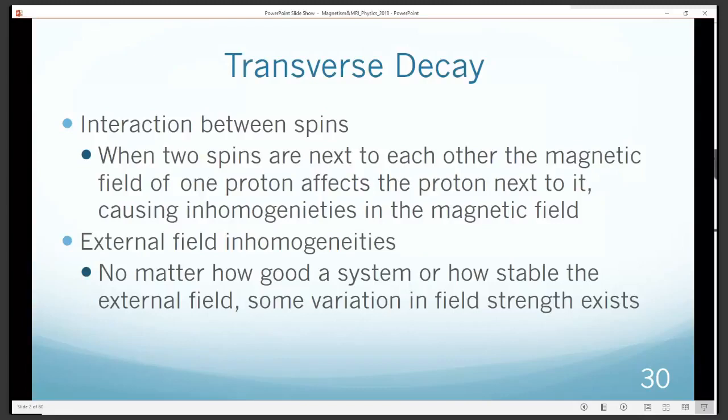And it's mainly, as the signal from the piano string decays, due to frictional elements in the string, causing its resonant properties to not be able to support this sound. The dephasing of the magnetic spins, or at least the transverse components of the magnetic spins, similarly, you can think of it as being the friction that causes the MRI signal to go away.